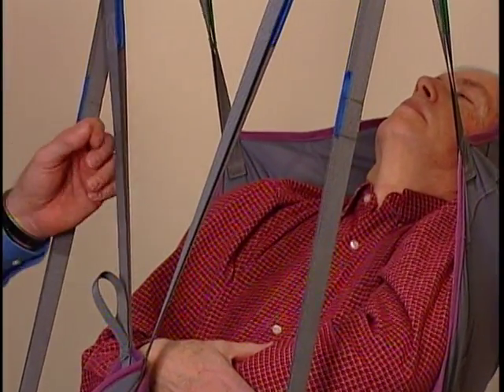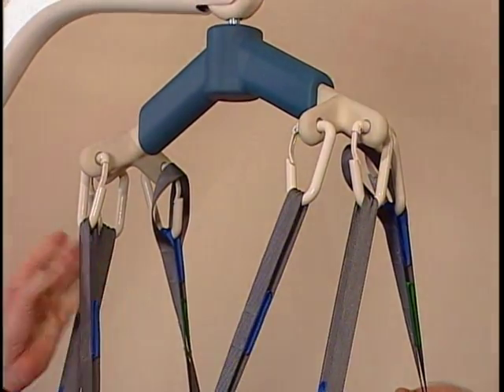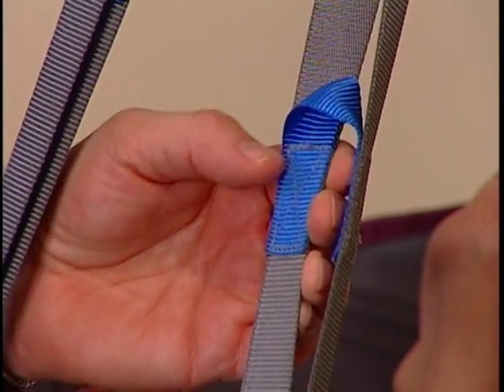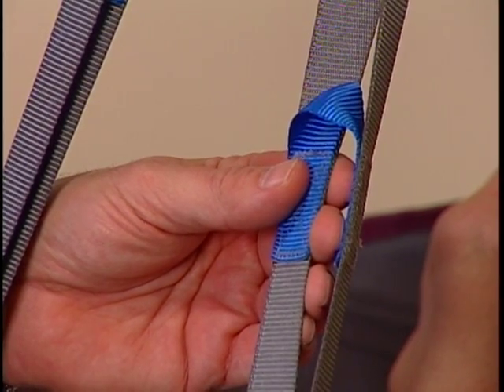Divided Leg, Universal, and Easy Fit slings attach to the lift with either four or six straps for easy positioning. They are reinforced at all points of attachment for safety. Each strap has a series of color-coded loops sewn into them, which allows the caregiver to situate the resident in a variety of positions from full recline to full upright.